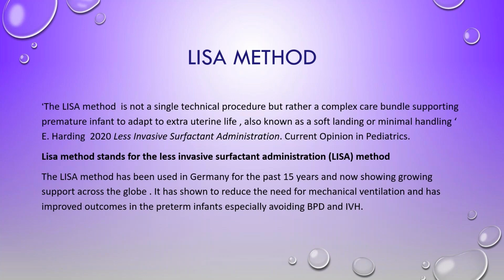And what they have learned is that they don't need to have this vigorous intubation with a big tube, but they actually use rather small tubes, a very soft tube. They don't put it straight down into the lung, they just put it past the vocal cords into the trachea, and the babies actually respond to it better than to generally trying to intubate.